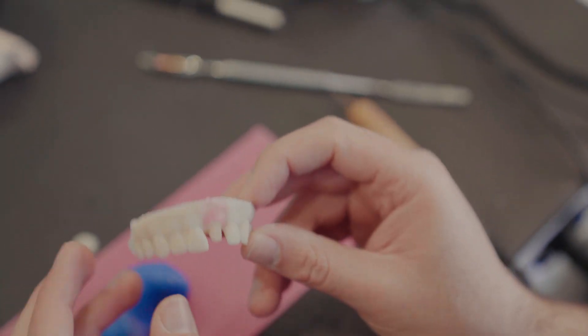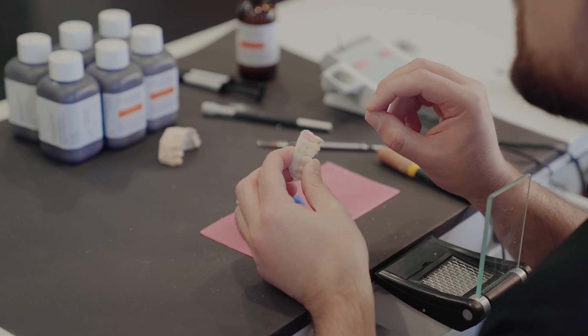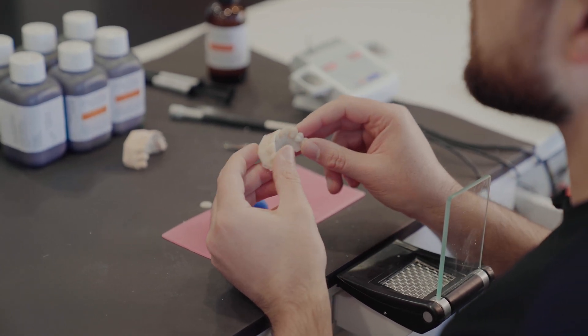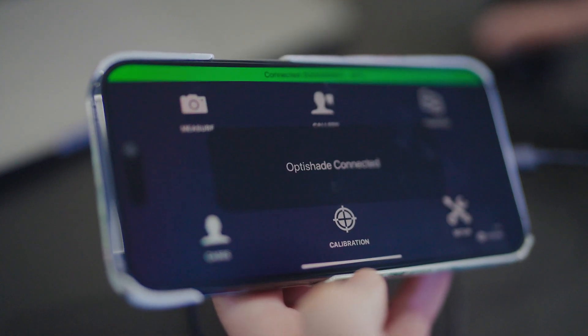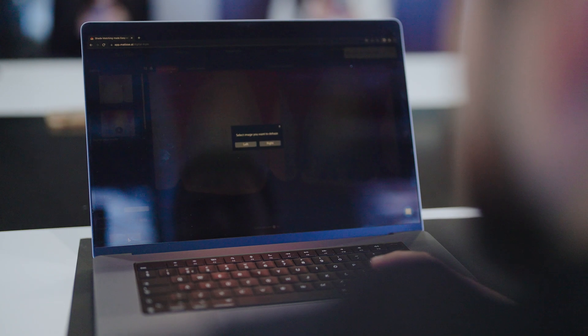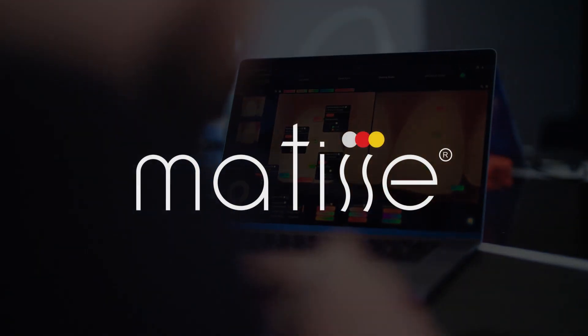This is very important for the Matisse OptiShade workflow, because when you work on this model you will see LAB colors which are more precise, and you can expect these colors to be the same in the mouth. This way there is no guessing anymore — predictability in color matching is one of the most important things in this process. The next step is framework staining, and I will show you how to stain the framework using Matisse and OptiShade. Matisse works like magic.